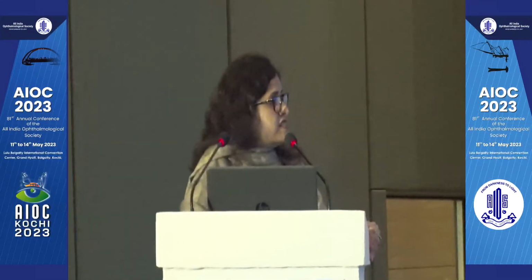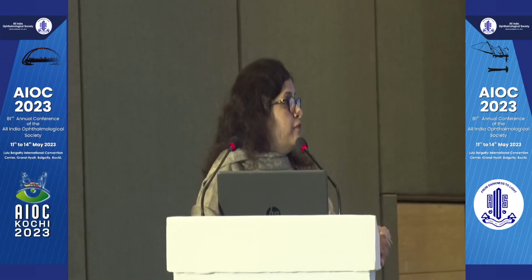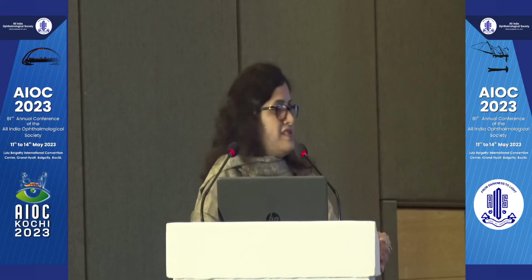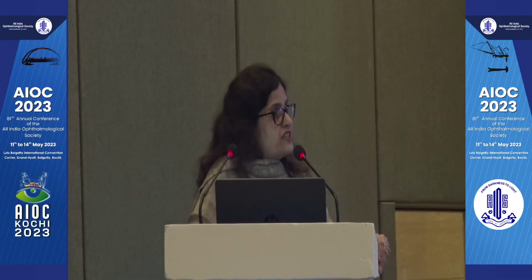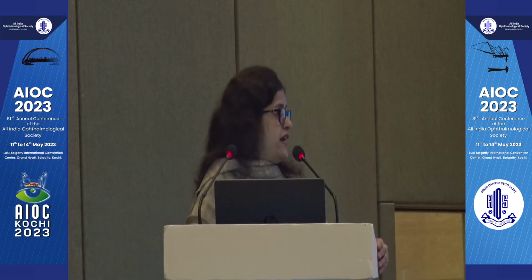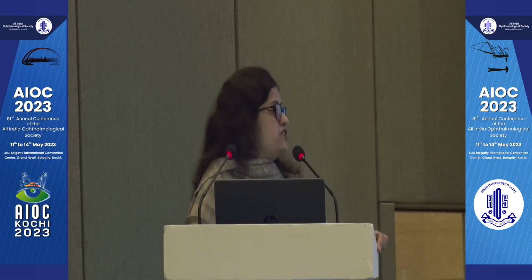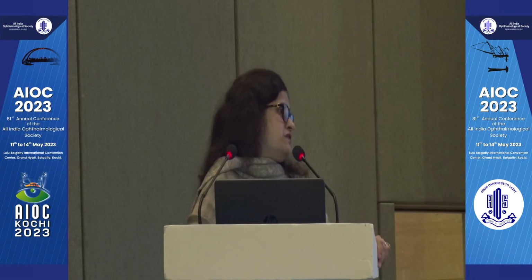You should be able to assess the systemic status of the patient also. The patient should be able to follow the commands. And I think it is better to instruct the patient pre-operatively about what you are going to do, whether you are going to tilt the head and how much, and the patient should not have any neck stiffness or any systemic condition which can be a constraint to your procedure.